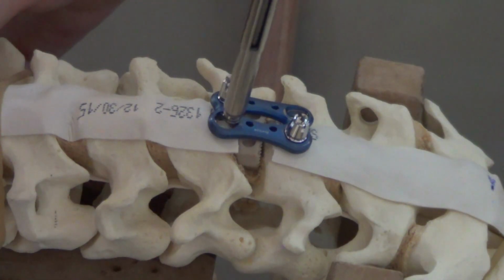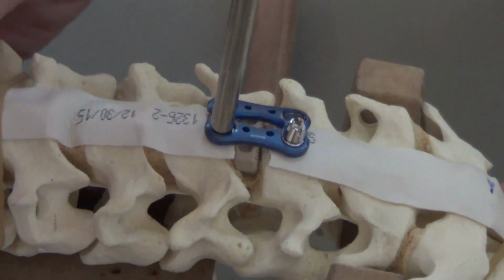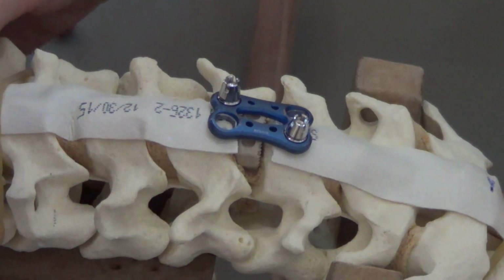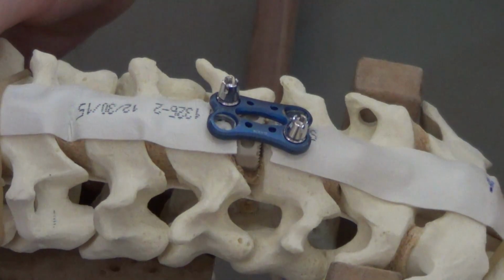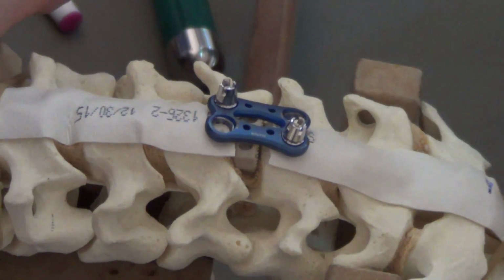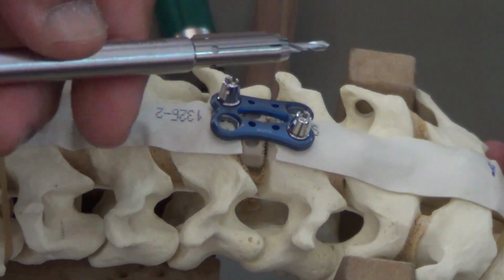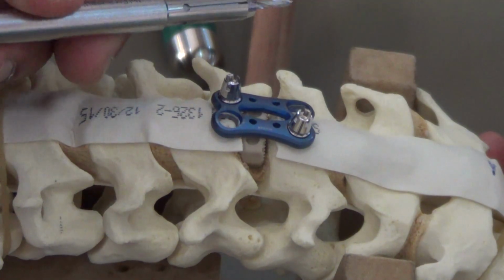So initially what you do, you use an awl to make a hole first with the awl. Then after that, you straight away put the screw, I think it's self-tapping. Nowadays, usually previously we have to make a drill. You see, if you have a whole set, you will have to use a drill set to make a hole. And of course, if you have this old set, remember that you adjust the drill so that it is not more than 16 millimeters.